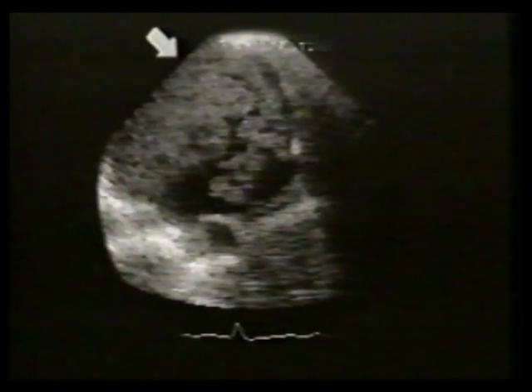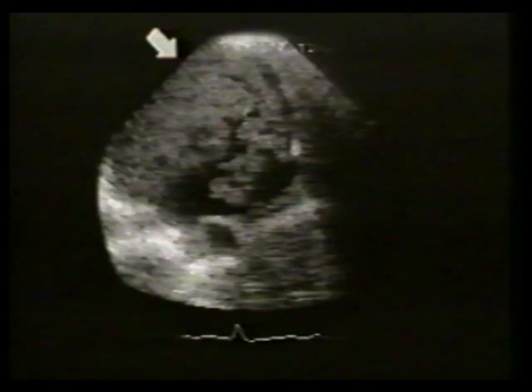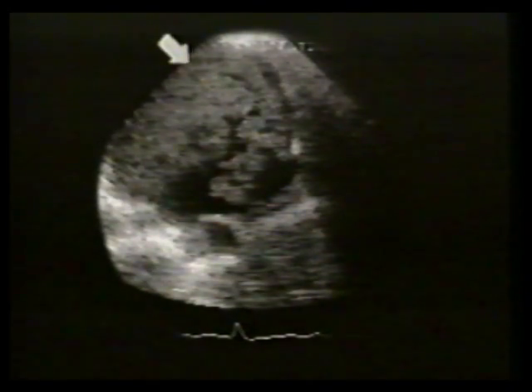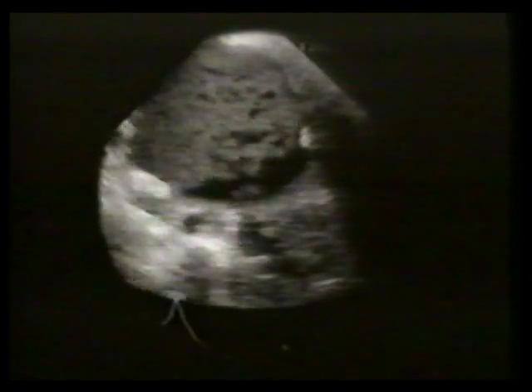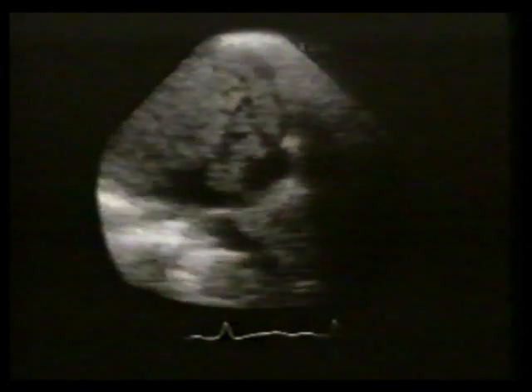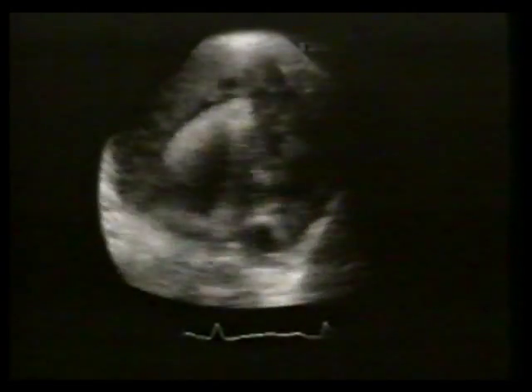This view was obtained by tilting the transducer inferiorly from the standard apical four-chamber view. The etiology of this cerebriform mass of echoes was clarified by echo-directed pericardiocentesis, which was carried out both to relieve tamponade and to obtain fluid for culture. This fluid grew a gram-negative organism called Moraxella. Subsequent pericardiectomy was performed, and the patient has done well in the intervening 6 years.